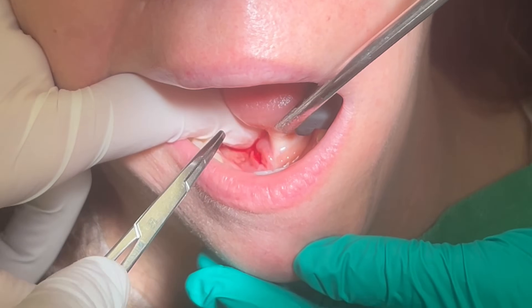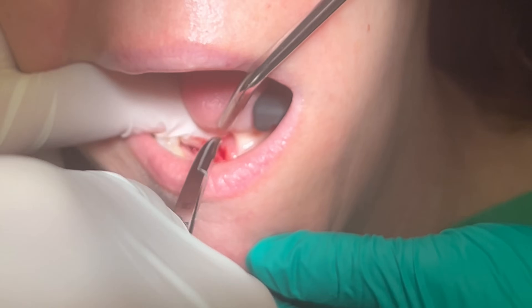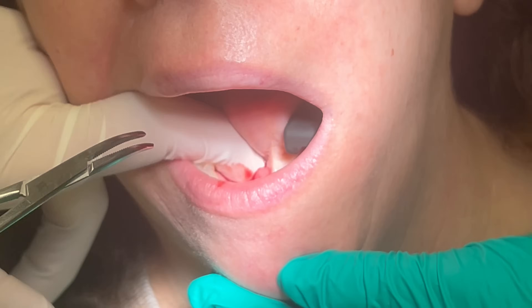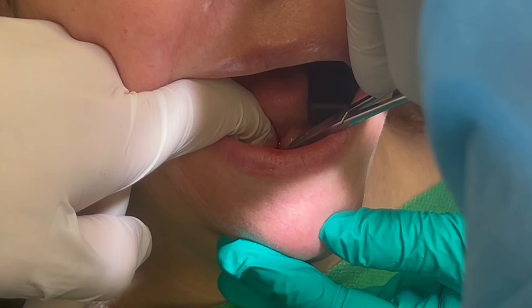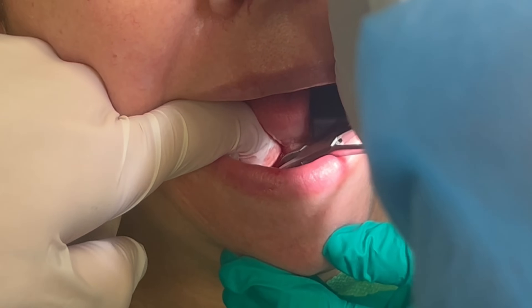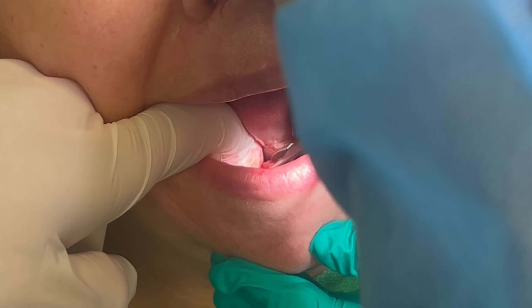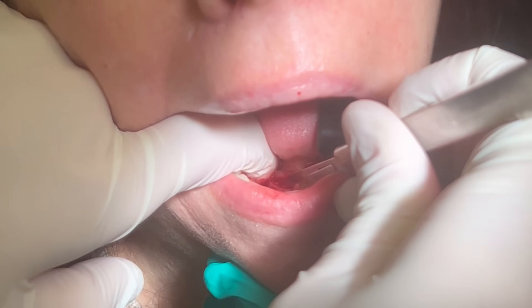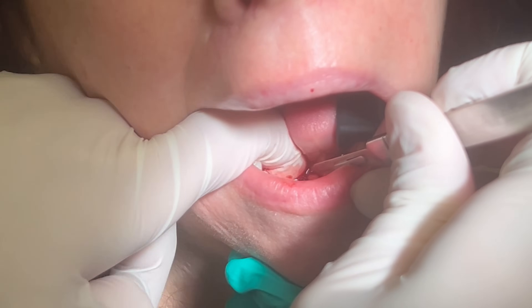Now I use a hemostat to dissect into the floor of the mouth and around the sialolith. I use a 15 blade to free the duct directly over the sialolith. I can see it coming into view here.